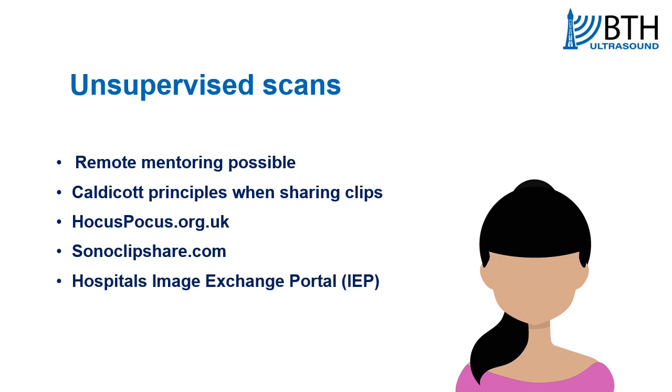And then the one that is particularly within the UK and further afield is the hospital's imaging exchange portal. So this is the system that the medical profession, radiologists, would use to send images over longer distances for second opinions, or when patients move from hospital or care provider to different care providers. So you could potentially get access to those systems and share your images in that way.